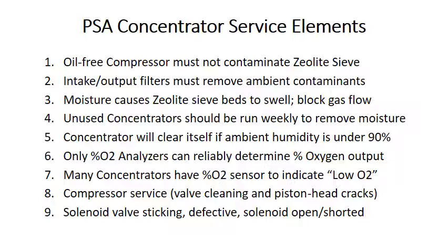Other things to consider are compressor service. There may be a need for valve cleaning or checking for piston head cracks, or it may be the compressor is not serviceable. It depends on the model. Other possible failures are things like solenoid valve sticking, a defective solenoid opener, or a short on the four-way solenoid or the exhaust solenoid. These are just some of the things that are possible.